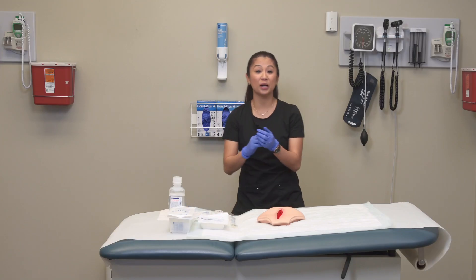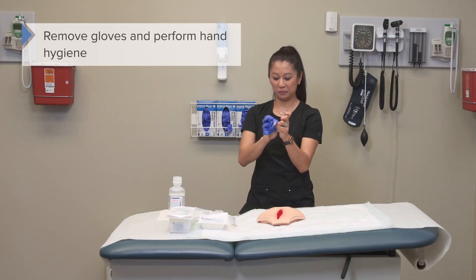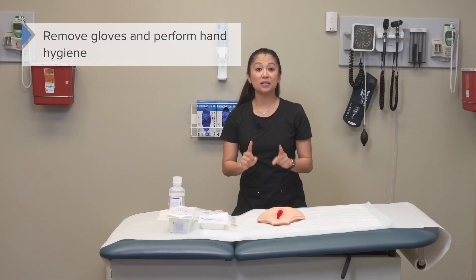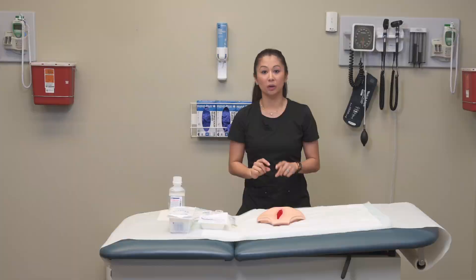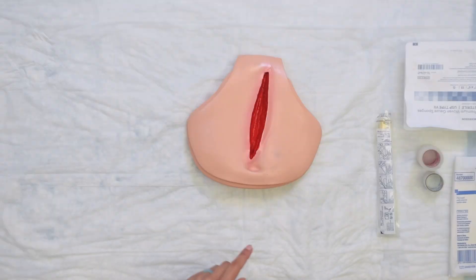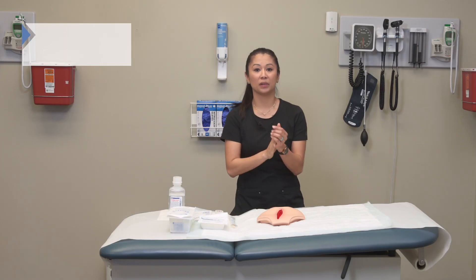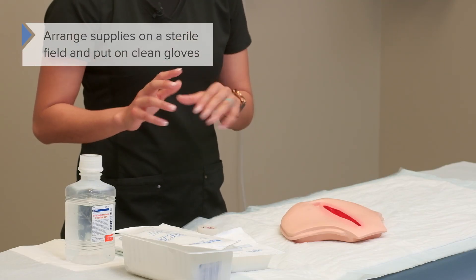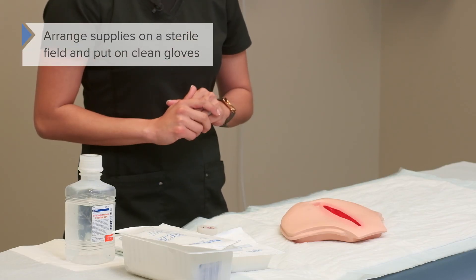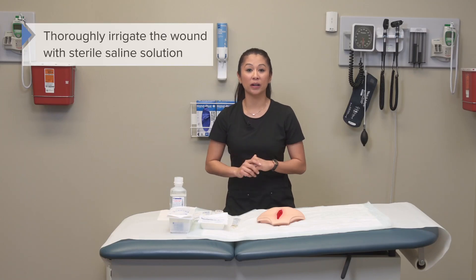It's a great idea to have a trash can close by. Now is the time to assess the wound and the surrounding tissue — more than likely we're culturing because something is going on. Once you've assessed, arrange your supplies on your sterile field to prepare to irrigate, then put on clean gloves and perform the irrigation with the prescribed solution.